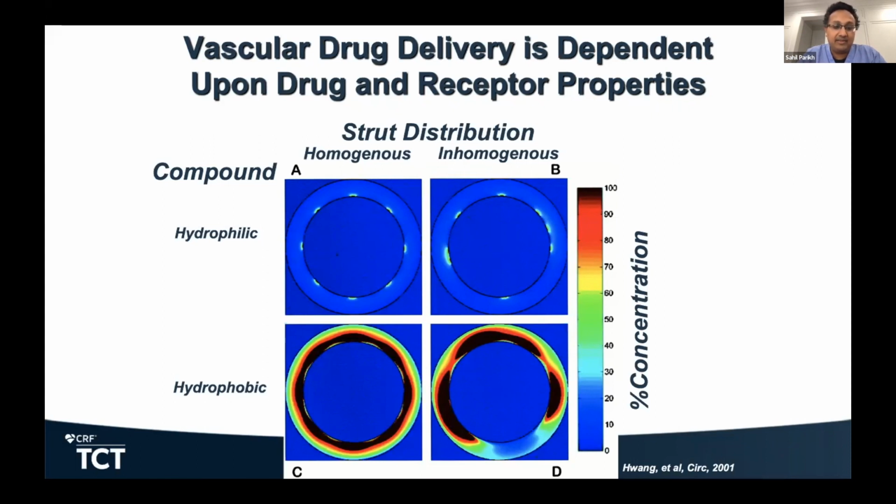The challenge, on the other hand, with drug-coated balloons is the excipient, getting the right secret sauce, if you will, of excipient and drug so that it binds to the balloon, can deliver to the target tissue, and then be released and allow the drug to bind. That's the tricky part. That's why drug-coated balloons in some ways are more complicated.